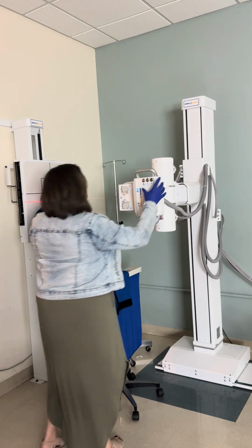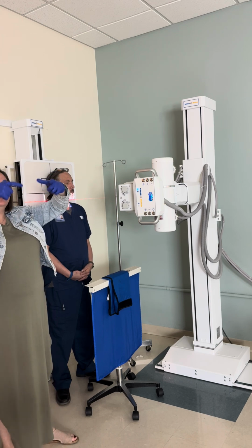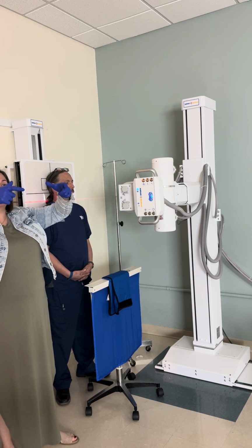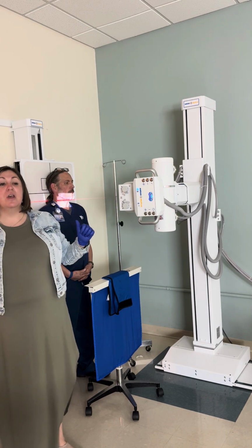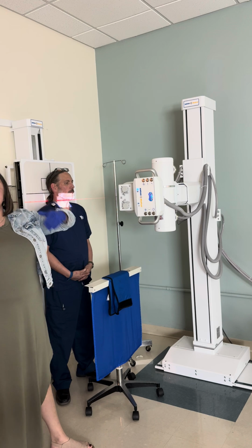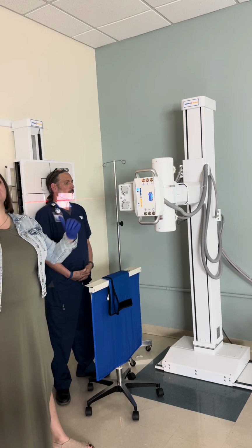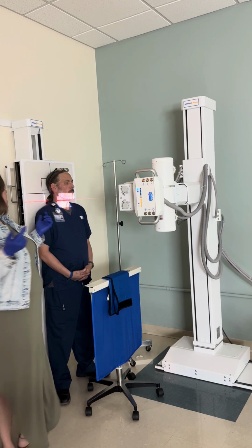And the point here is when we find that mastoid tip and that upper incisor, we're gonna tilt the head back and forth until you have that in a straight line with one another, perpendicular with the image receptor. Okay, and what that's doing is getting the base of the skull and the upper teeth in line with each other so that we can see the odontoid process through the middle of the mouth, right?